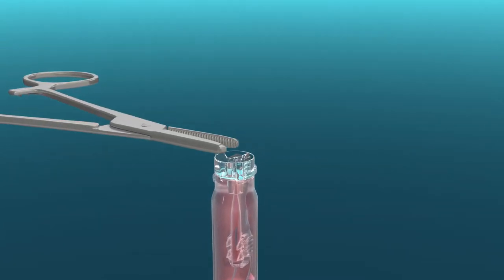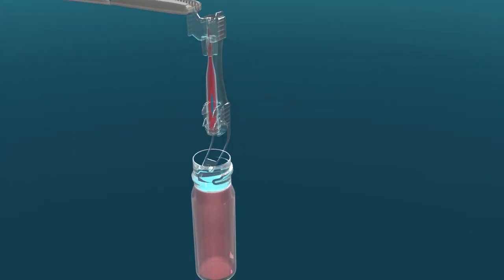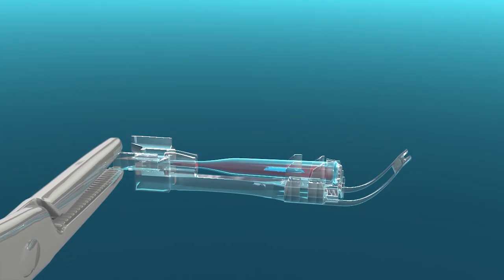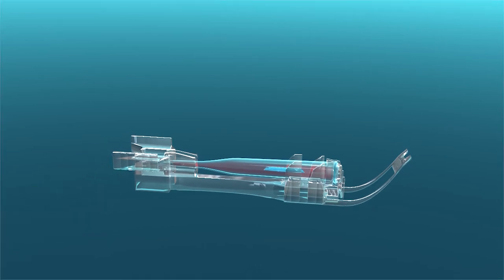Using sterile hemostats, remove the preloaded cannula system from the flask. Place the preloaded cannula system on the sterile field with the cannula facing up.